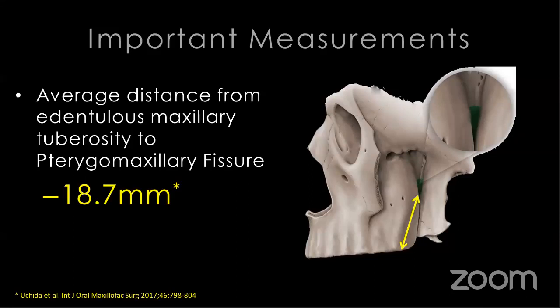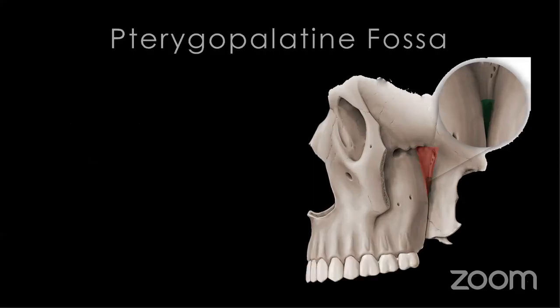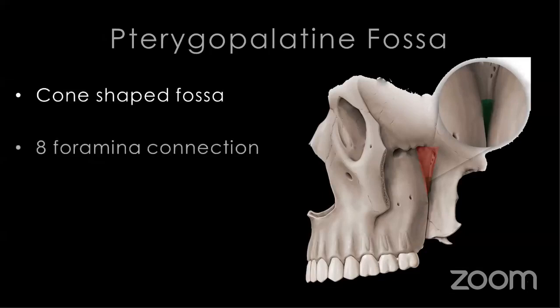And knowing these measurements and these angulations and this anatomy is very important so we can avoid damaging these vital structures. So the pterygopalatine fossa, this is a cone-shaped fossa.